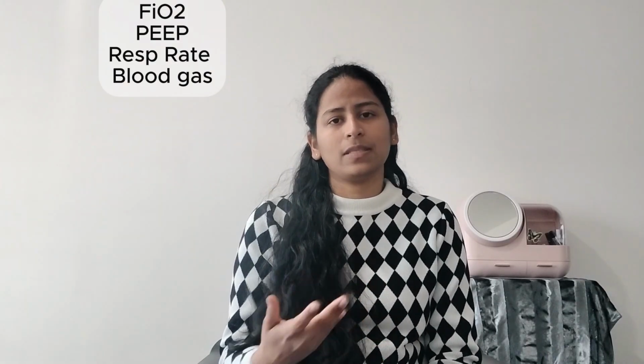The other factor is the PEEP, which is positive end expiratory pressure. So it is the pressure exerted onto the alveoli in expiratory phase so that they don't collapse. So 5 is like the minimal or basic amount of PEEP you can give. The other is the respiratory rate if they're having a respiratory rate less than 30 and their saturations are more than 90%. You would also want to do a blood gas just before extubation to see their pH levels and other PCO2 and PO2 in the blood gas as well. And you want them to be around the normal range.